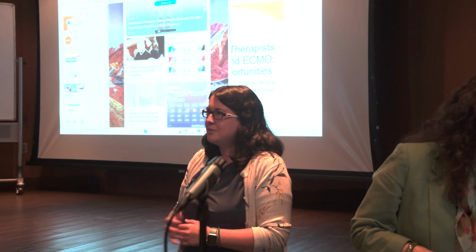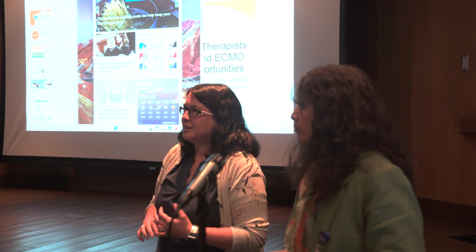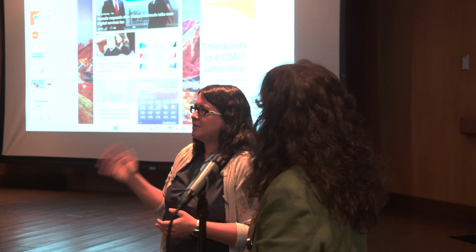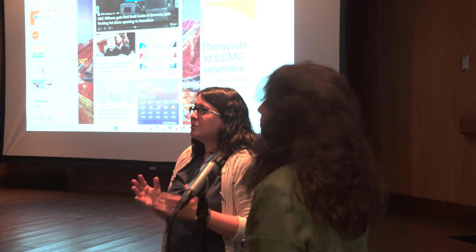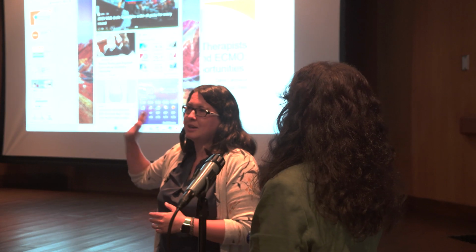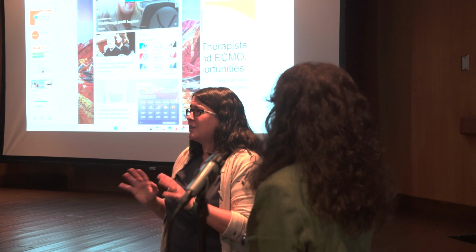And I think, like most of you see, when you're trying to do an optimal PEEP study, are there hemodynamics where you want them to be? Like if the patient's desaturating, they don't like that. Are they getting tachycardic or hypotensive? They don't like that. So we go for the highest PEEP that the patient can tolerate. And then usually we're trying to get about what we would call 4 to 5 steps, because that does help you get a better data set with that line of best fit and those graphics. But again, it's what the patient can tolerate.